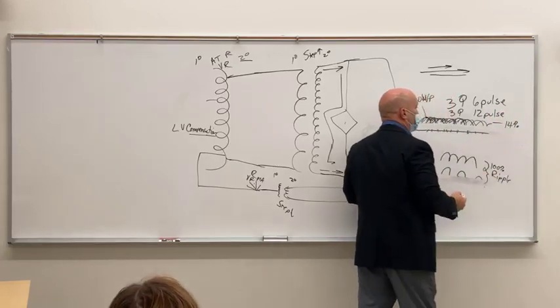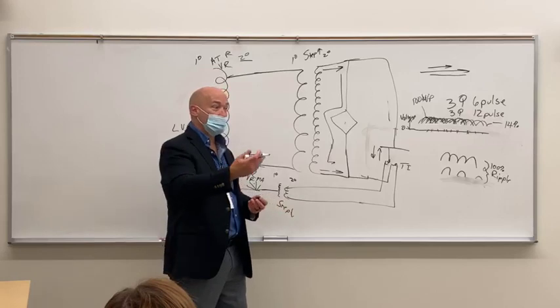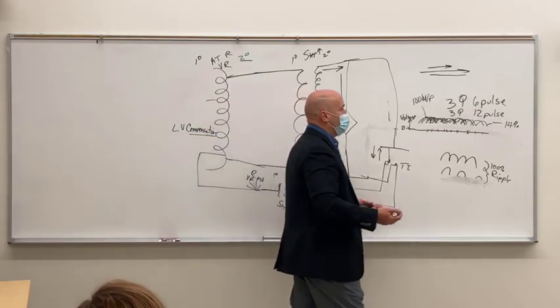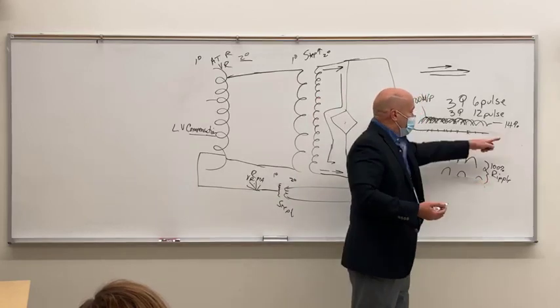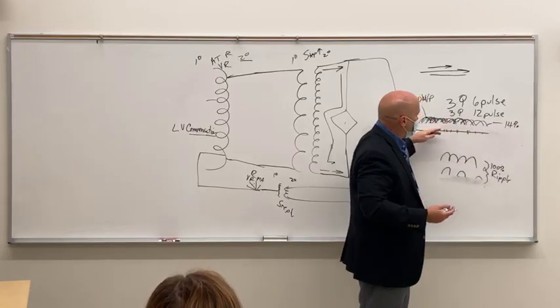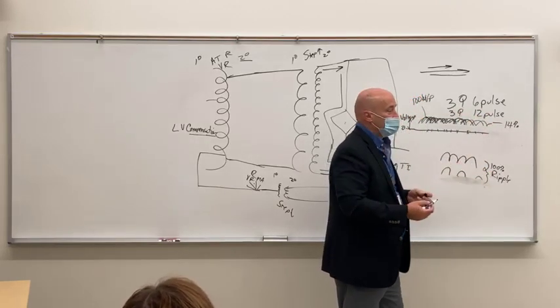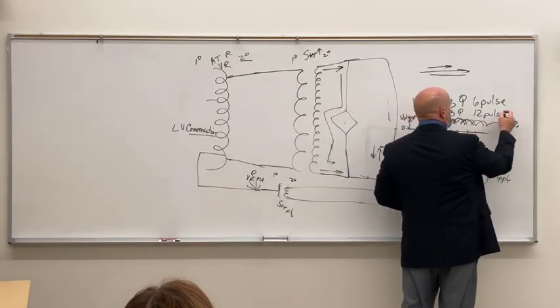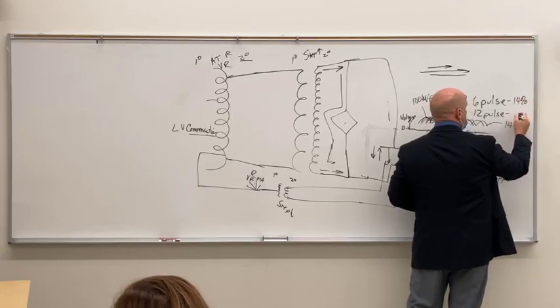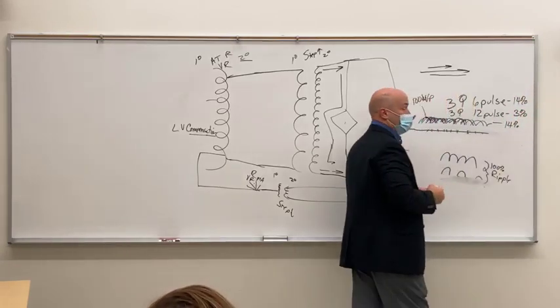Do we not again increase our average energy? Do we not increase the efficiency and the output of our X-ray tube beyond this, and have less voltage ripple, less of a change in swing between peak and the minimum energy? The answer is yes. So with 3-phase 6-pulse, we get 14% voltage ripple. With 3-phase 12-pulse, it's around 3%, so it's pretty consistent.